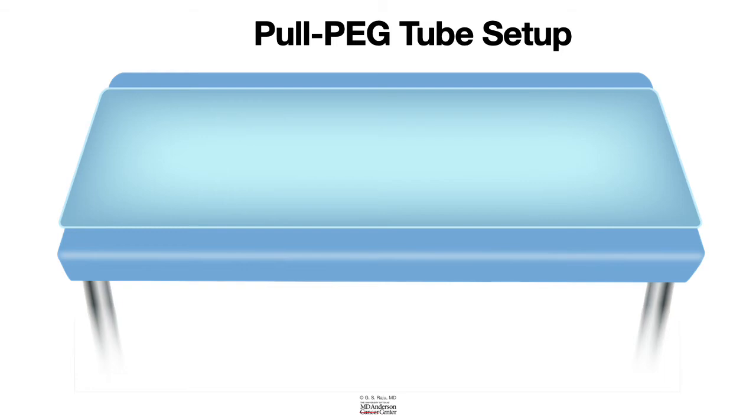It comes in a kit, and when you open the kit, you will find a lot of items that are used for different steps in placing a PEG tube.